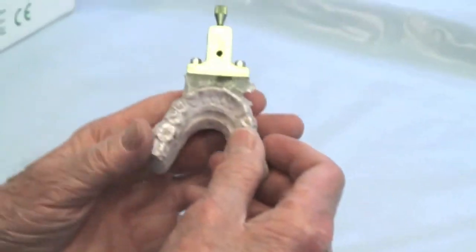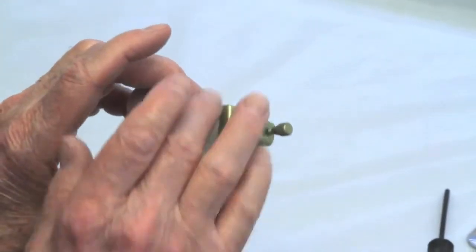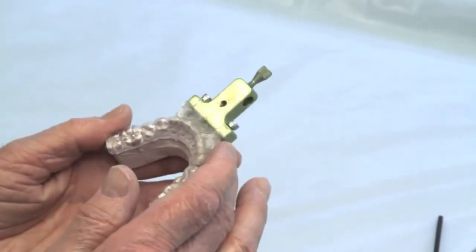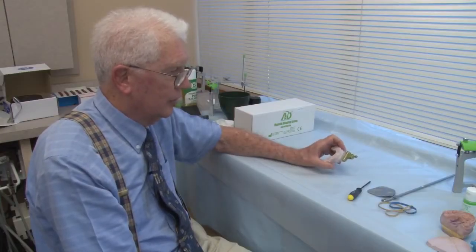And you see now we've got excess acrylic, and we have to go in and cut away the excess acrylic, use sandpaper, and smooth it all up and clean it up. So that's the way you go about making your clutch for your patients.